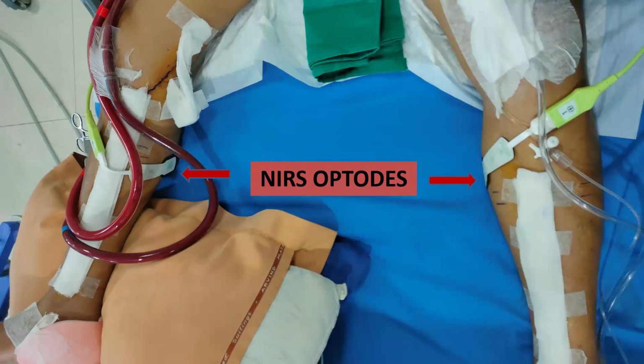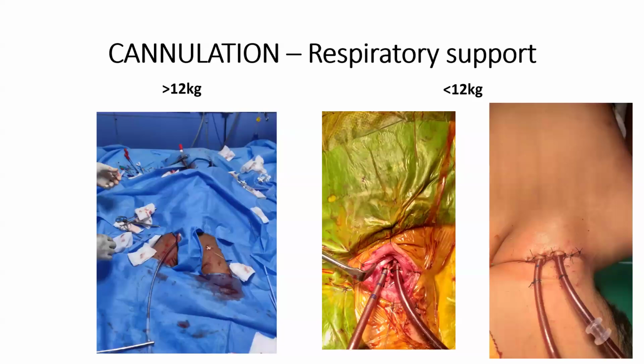Coming to the pediatric cannulations, in our center, if the body weight is more than 12 kg, the cannulation is done according to the size of the baby. But if the baby is less than 12 kg, because of the small lower vessels, you cannot put in a venous drainage cannula there. We have to create the carotidojugular ECMO. So we cannulate the carotid, we cannulate the jugulars under surgical vision, and we can go for carotidojugular ECMO.